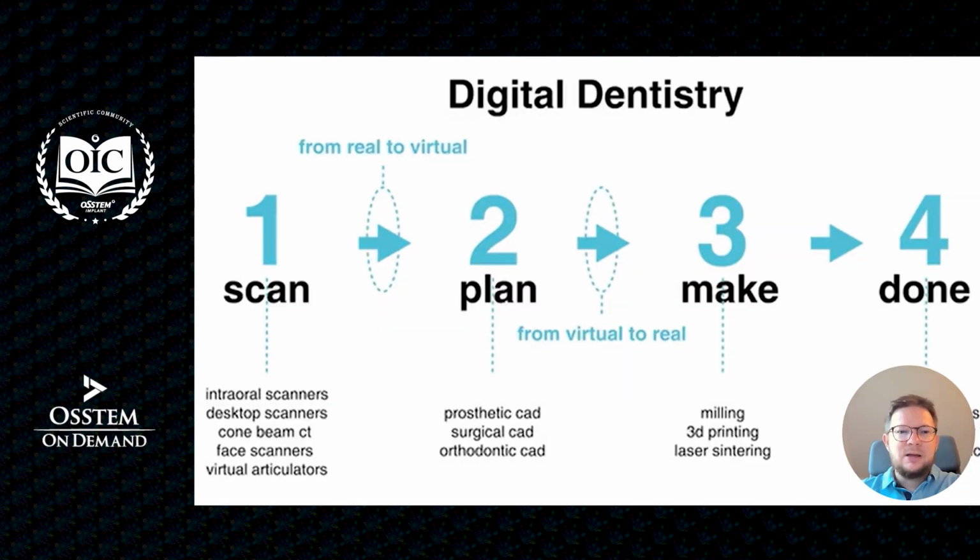And according to digital dentistry, we have a few steps in the workflow of digital dentistry or implantology.